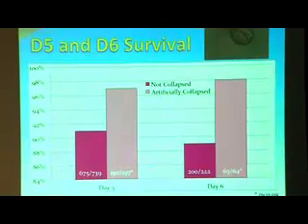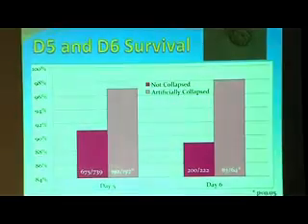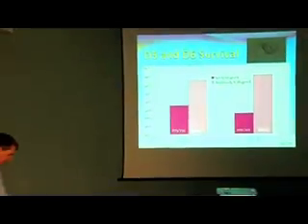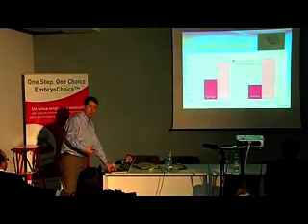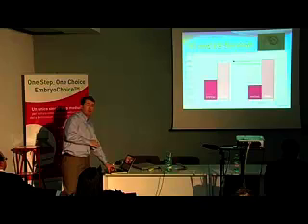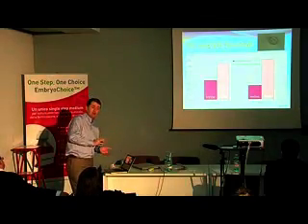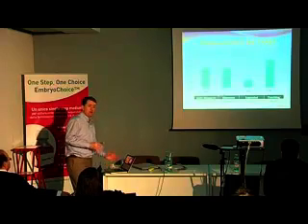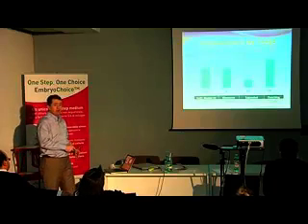Another thing that we noticed was that, whereas day 6 blastocysts had lower implantation rates before, once we started collapsing these guys, the implantation rates for day 6 blastocysts were just as good as they were for day 5 blastocysts. So that's a technique that, when I talk to embryologists about doing vitrification, I say this is something you've got to do. Especially if you have big blastocysts, you've got to collapse them down. You've got to force them to shrink down and evacuate the fluid out of the cavity before you vitrify them. With smaller embryos down here, it doesn't seem to matter, but these big guys right here, you've got to get that fluid out.